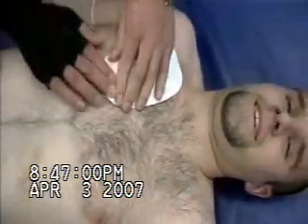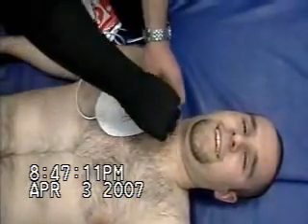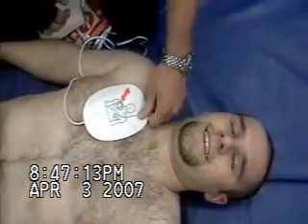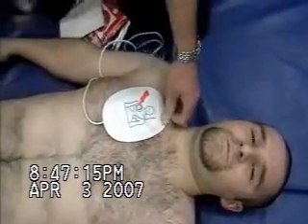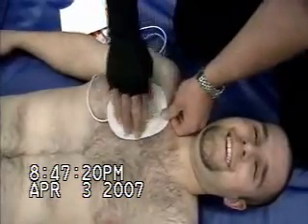Now just to make sure, we're going to see how much hair is there. Top to bottom or bottom to top? Top to bottom. He's like, I changed my mind. Can I do it fast? Ready? Get a good grip. I want you to go straight down. Don't tear the pad. Make sure you've got a good grip on the pad, because we wouldn't want to have to do it again.